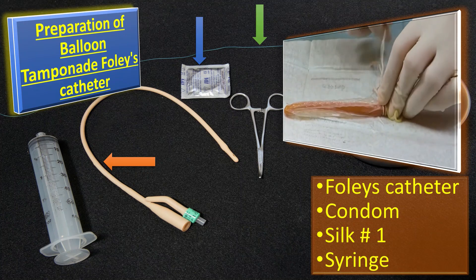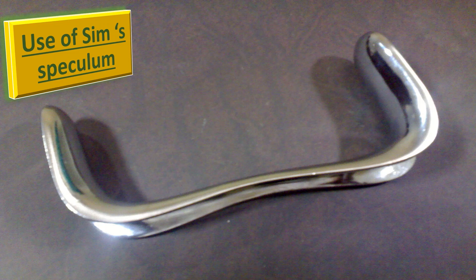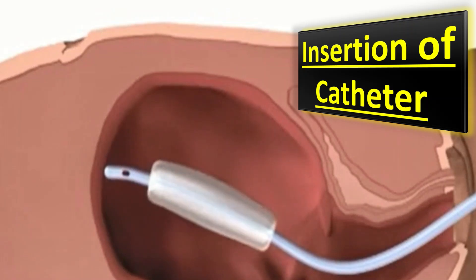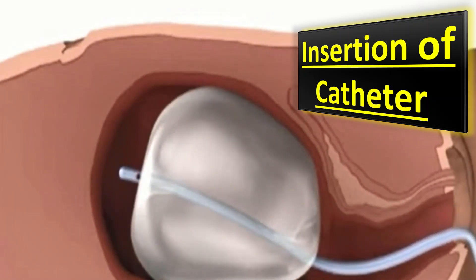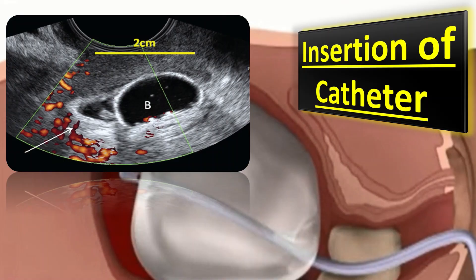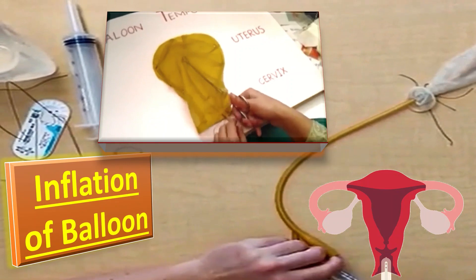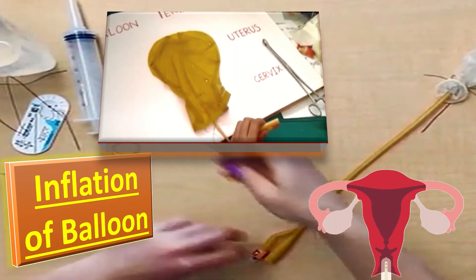I will take a 50cc syringe for filling. I will ask my assistant to retract the posterior wall with a Sim's speculum. I will hold the anterior lip of the cervix with a sponge-holding forcep and insert the catheter fitted with the condom inside the uterine cavity, taking it to the uterine fundus, preferably under ultrasound. I will then inflate the balloon catheter with normal saline, approximately 250 to 300 ml, using a 50cc bladder syringe, and ligate the lower end of the catheter to prevent backflow.